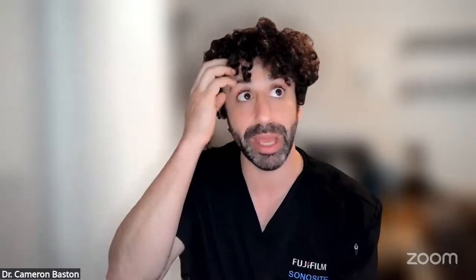Or, man, we can finally see this focal pneumonia. We can focus on our antibiotics. We don't need to worry about diuresing this patient who might be becoming septic. And so, to me, the training question is really one of how do we best integrate this into the training paradigms that exist for different professions, so that we can get people to start using this at a time when it matters, as opposed to when they've already developed their own protocols and we're trying to convince them to change something. I don't know if that's what you're hoping for, Chris.